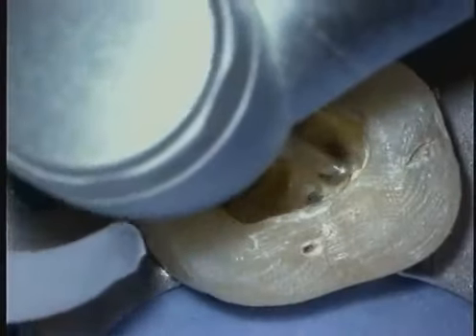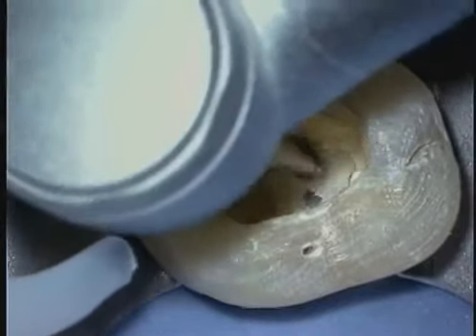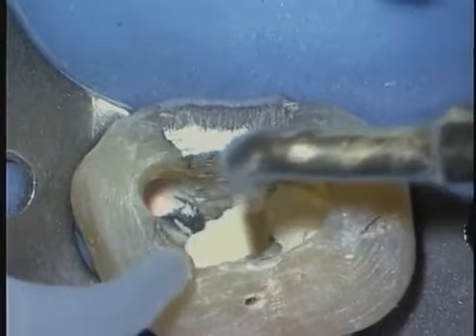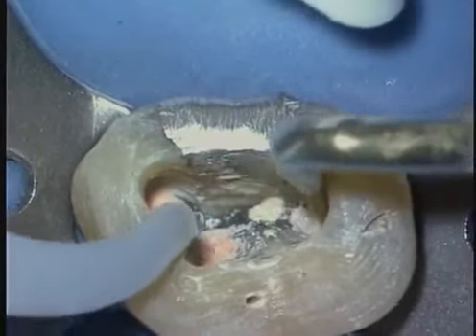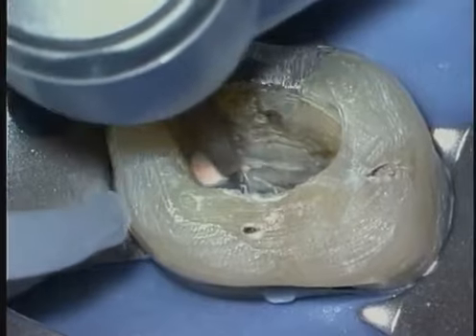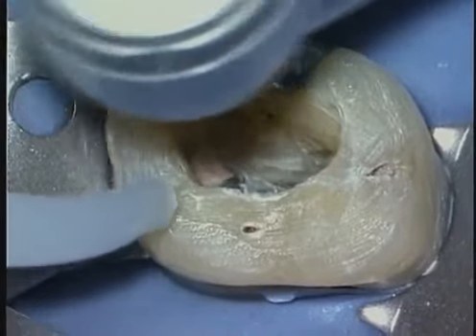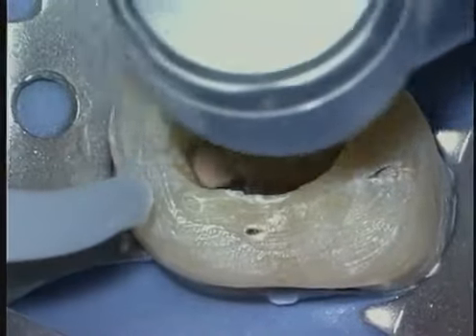In this instance, it's good to use the surgical length burrs because, again, they provide better vision, and ultrasonics disintegrates and blows out a lot of this debris very rapidly and very safely. Notice the great vision you have lateral to the instrument instead of looking at the back end of a handpiece. True those walls up as per usual because, again, it refracts light and we can begin to get a better sense of the anatomy off the pulpal floor.